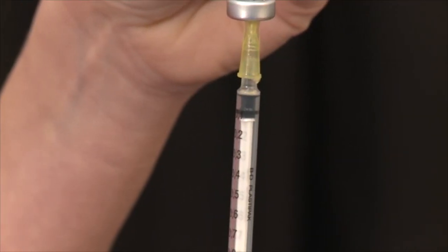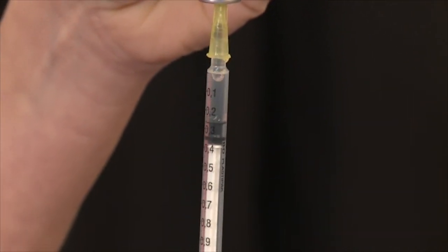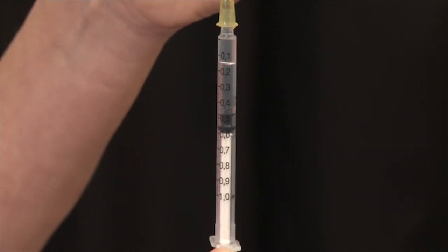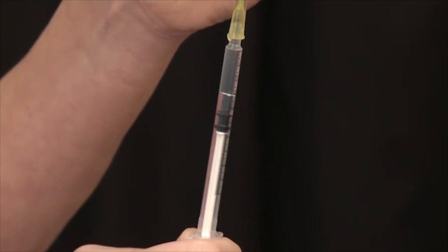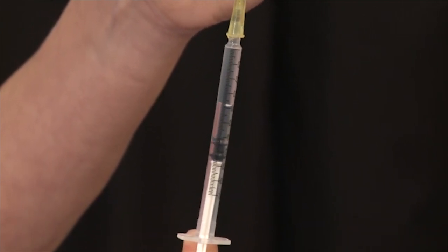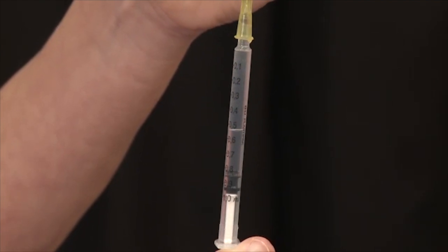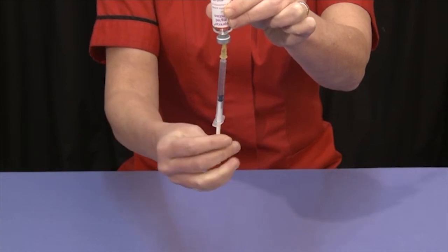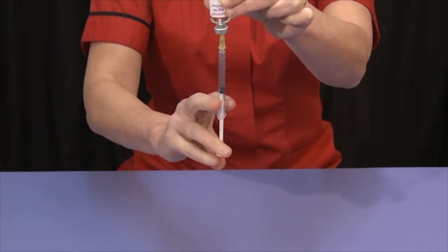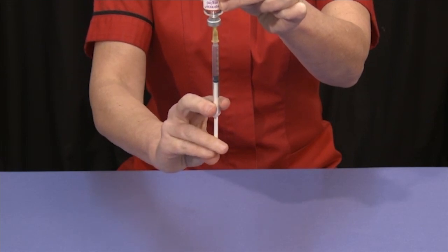Slowly withdraw the plunger so that the Bucerulin solution begins to fill the syringe. As the needle is very fine, the Bucerulin comes out quite slowly. Ensure you withdraw a little more Bucerulin than you intend to inject. Your clinic will have told you how much Bucerulin to inject. Slowly push the plunger back up until the required amount is in the syringe.